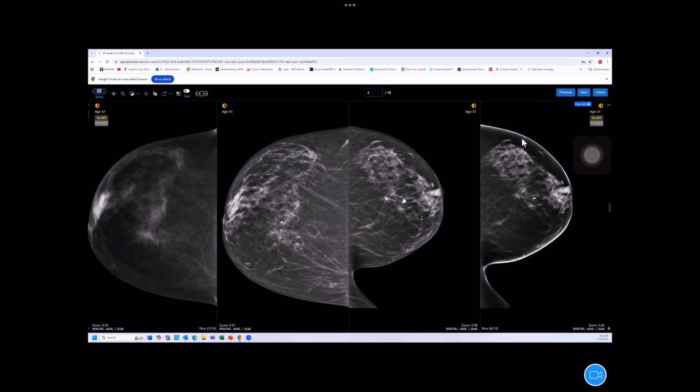Okay, now in this particular case, if we scroll through, we can see quite easily the scar. Tomo is great for scars, right? And it shows you very easily where the scar is. But what it also highlights, and brings to your attention, is that while this pattern out here might be normal, for example, a normal soft curvy sort of pattern, we have a strange connection out here to an irregular shaped mass.